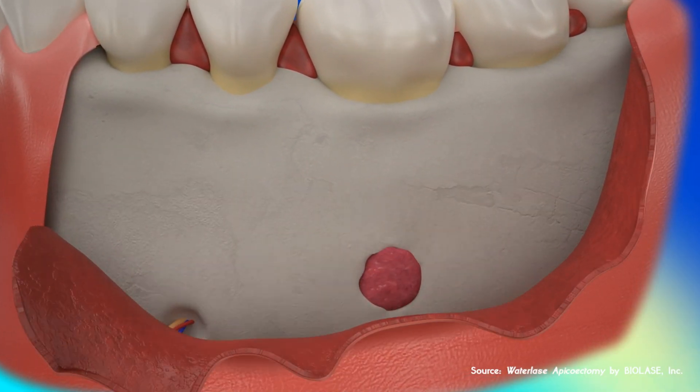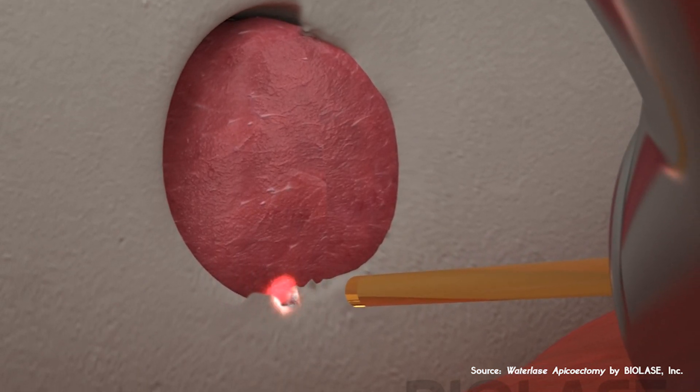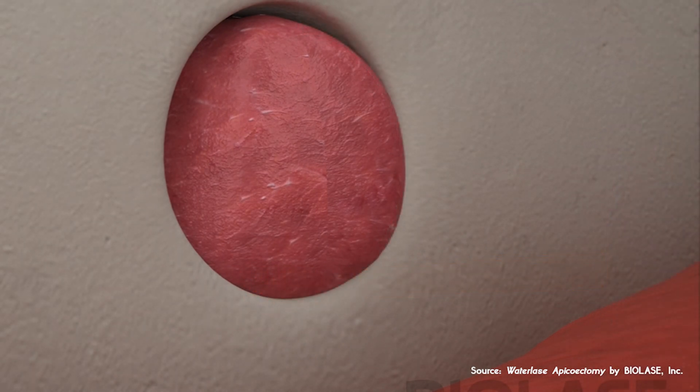It will be performed exclusively with a Water Lase iPlus by Biolase. The patient has a lesion at the tip of a root canal tooth, which is otherwise fine.